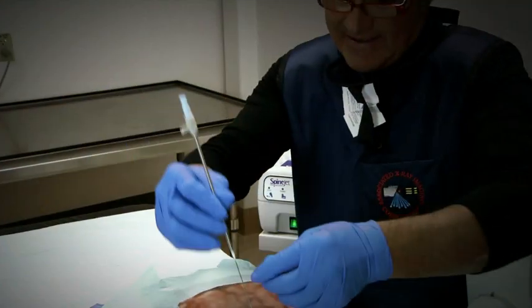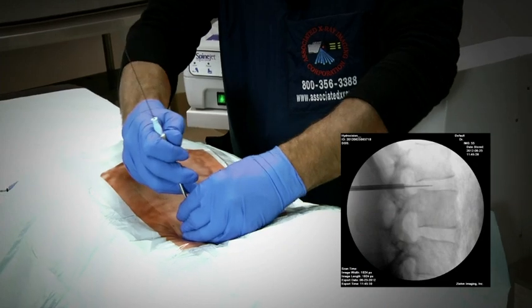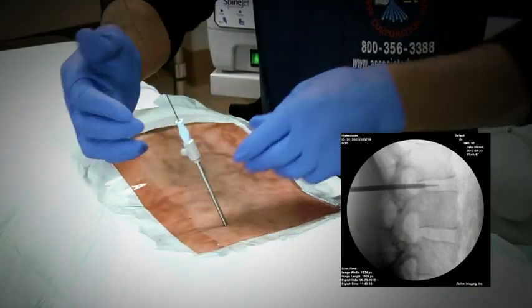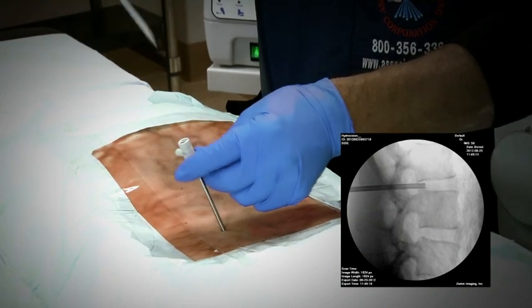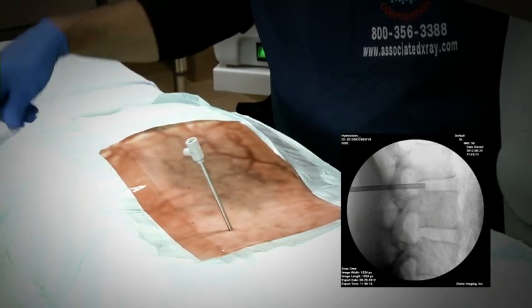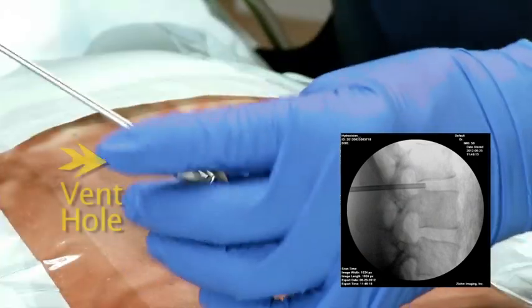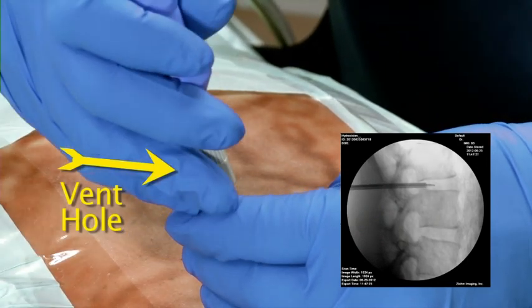Using the guide wire, advance through the annulus no farther than approximately one-quarter of the way into the nucleus. Maintain the placement of the cannula and unscrew the dilator, leaving cannulated access to the disc nucleus. Hold on to the cannula knob, taking care not to cover the vent hole, and insert the SpineJet PERC resector.